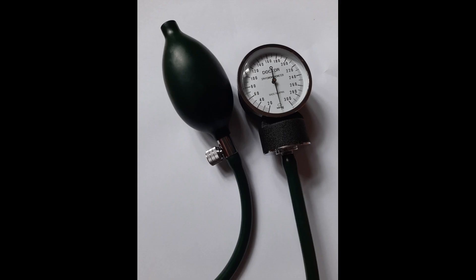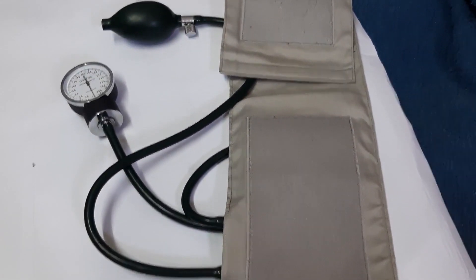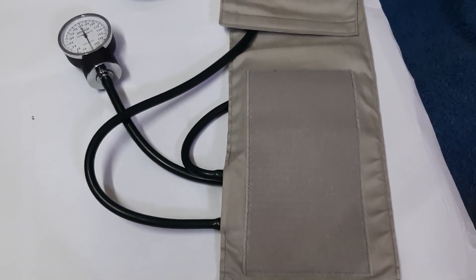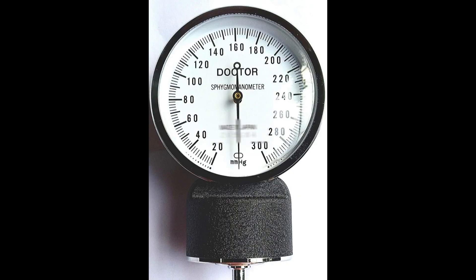Hello friends, today let's learn how to measure blood pressure. Here is an aneroid sphygmomanometer. On this dial gauge, the largest lines indicate units of 20, medium lines indicate units of 10, and short lines indicate units of 2.